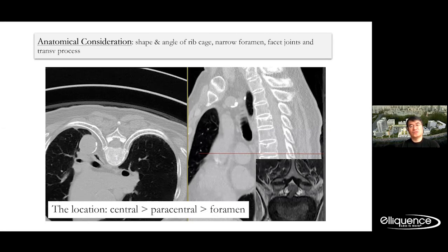That is due to, firstly, the incidence of thoracic disc herniation being quite lower than the lumbar and cervical. The second reason is that the technique is very challenging and it demands a high level of experience with transforaminal endoscope discectomy. That's why today's topic is tier 4, for experienced endoscopic spine surgeons.